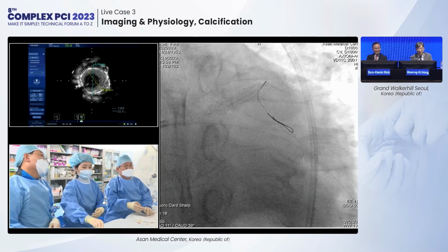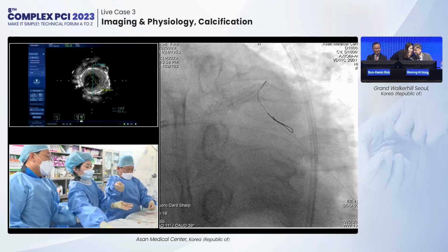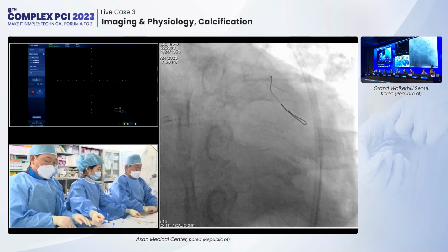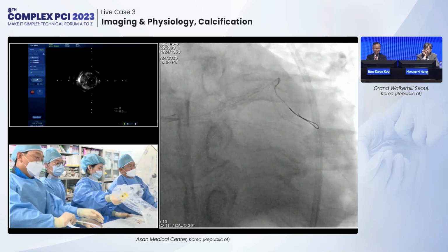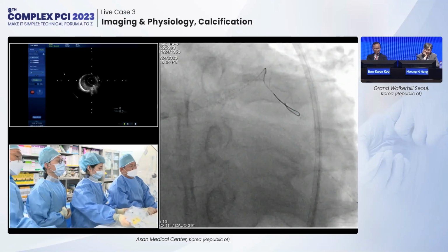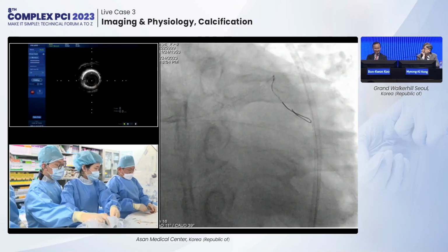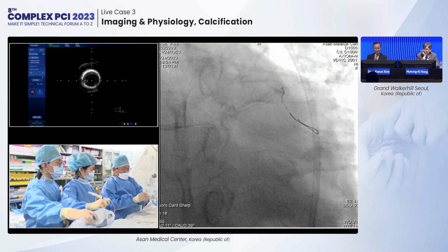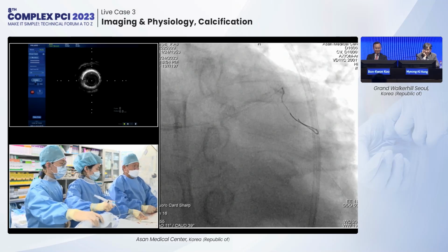What about the circ? Do you fix the circ or not? I will show you the circ stent again, circ IVUS. So you have an LAD FFR of 0.81 and circumflex 0.9. So the practical question is why the patient still has chest pain. Yes, that is very important, because the science should provide the objective number. At least based on the FFR and pressure evaluation, the perfusion pressure should be good. So we cannot 100% trust the patient's symptoms. Sometimes the patient is so sensitive to some chest discomfort. That's why we need the FFR evaluation when patients complain of unexpected feelings or discomfort.